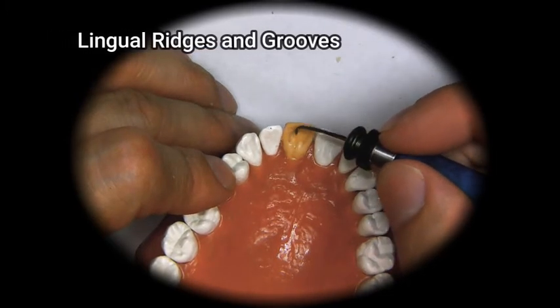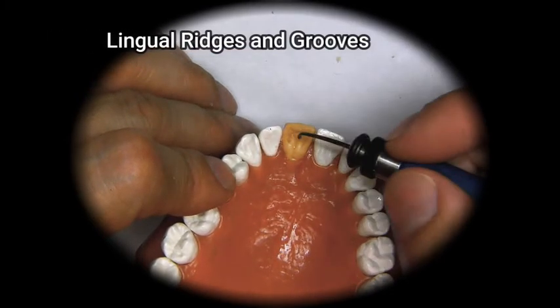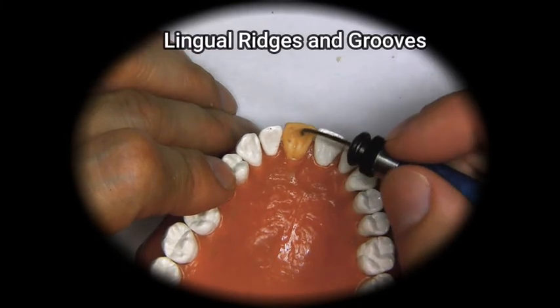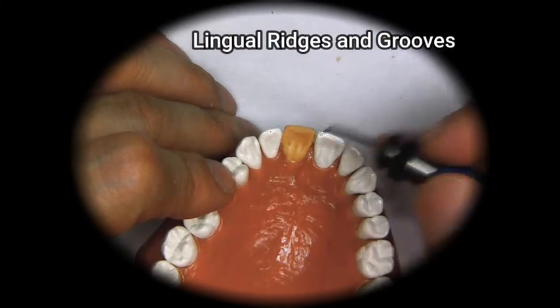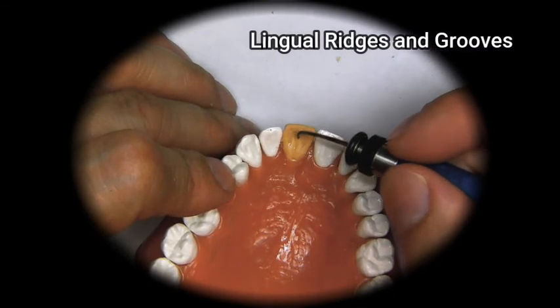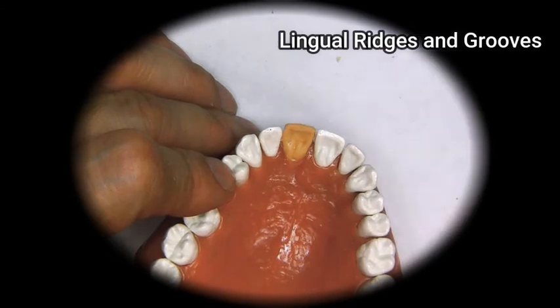Some dentists don't like to add any of that, and they just like to have a very smooth lingual plane to the incisors, just because some patients prefer that.